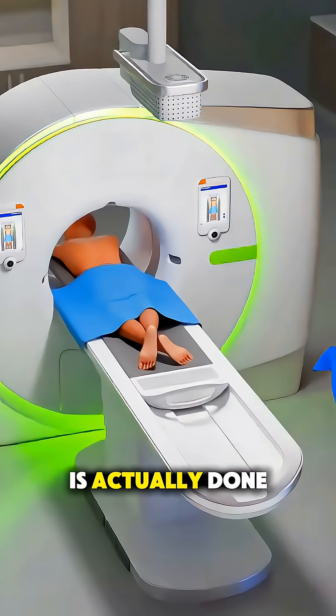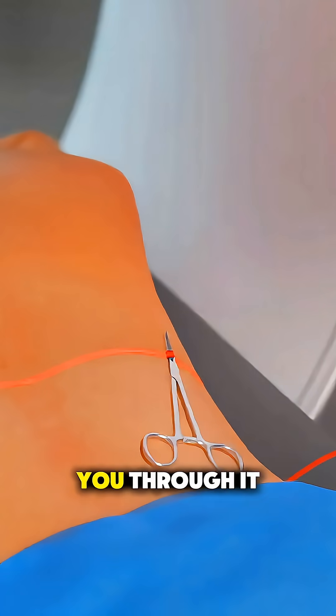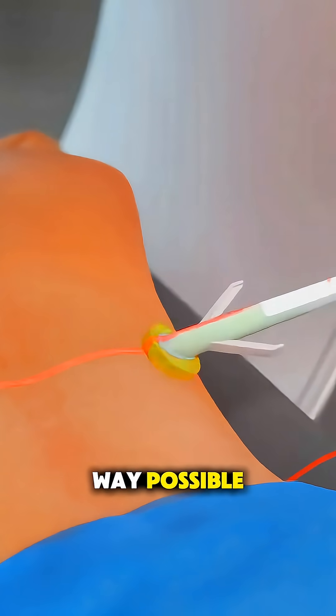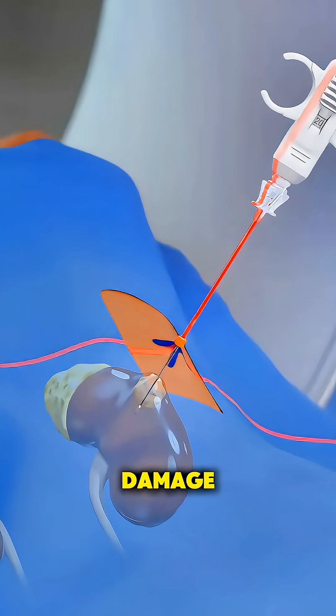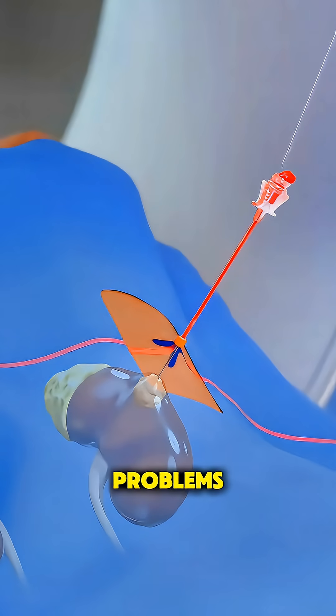Ever wonder how a kidney biopsy is actually done? Let me walk you through it in the simplest way possible. A kidney biopsy is a quick medical procedure doctors use to find out what's really going on inside your kidneys — things like inflammation, damage, or unexplained kidney problems.